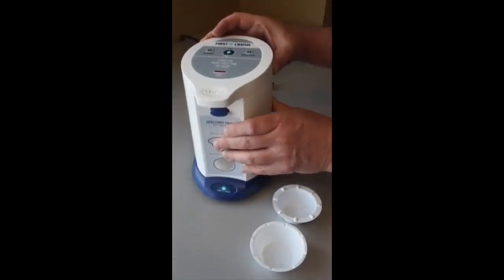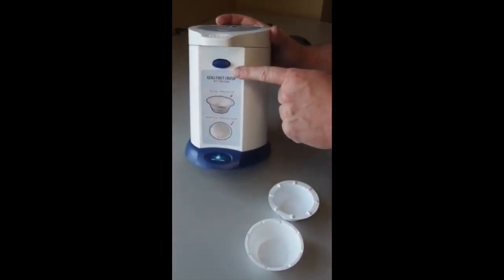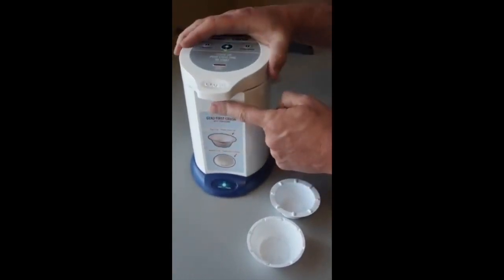To open up the unit, it's fairly simple. You simply push the blue open button that is located under the lid and lift the lid. This can be conducted either with 2 hands or with 1 hand once you become familiar with the unit.